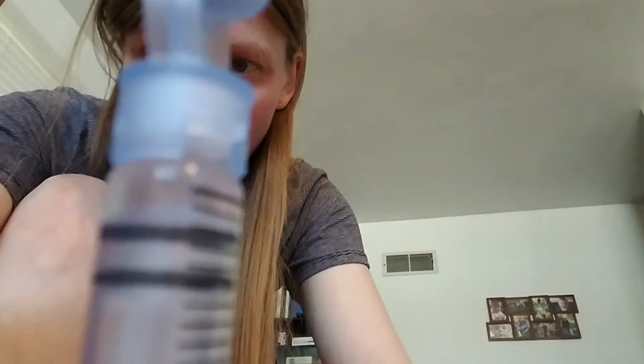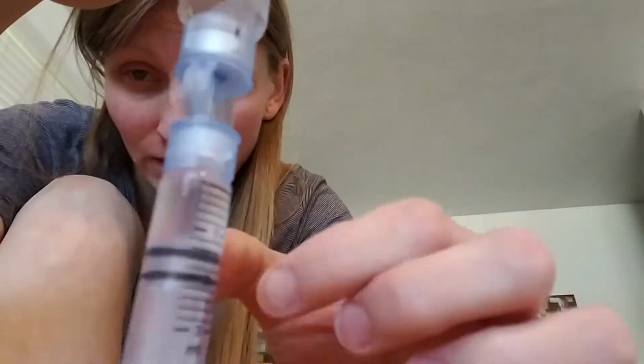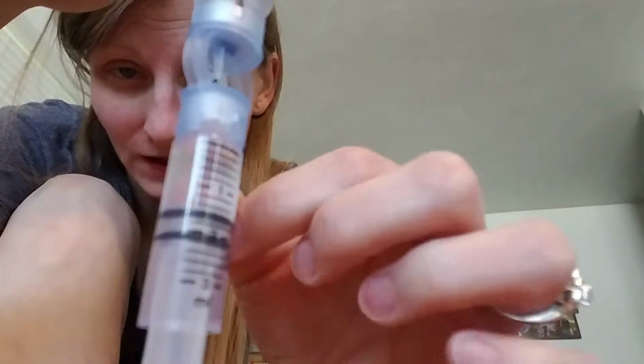So I turn it upside down, and you can kind of see there how it's slowly filling itself. I don't have to just let it fill itself. I can help it along. I just thought I'd show you how it suctions it in. I can see a bubble in there already. So I flick it, make sure it's at the top where that needle comes in, so I can push it out.